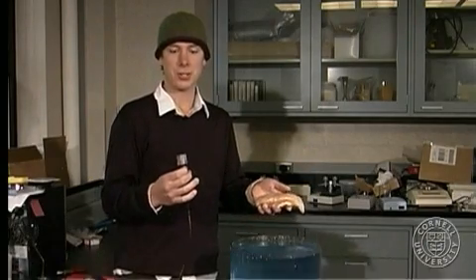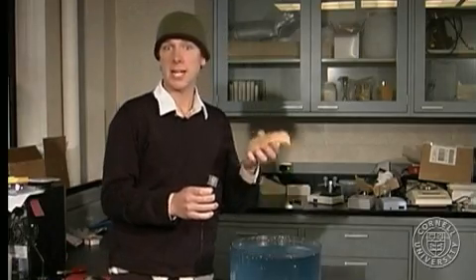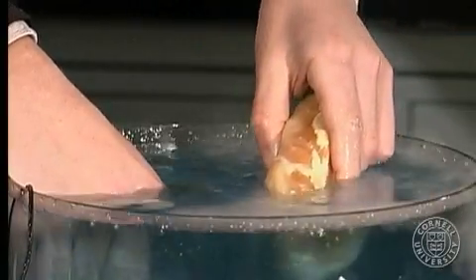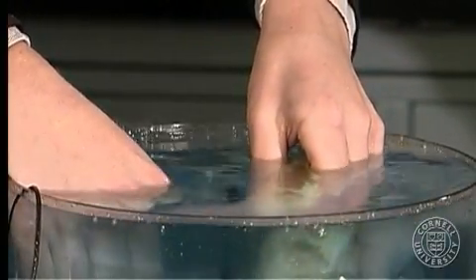Here we have fresh tissue and our ultrasound transducer. We're going to use ultrasound power or energy to burn this tissue that might be in the human body and potentially could be a cancerous tumor. Ultrasound energy is on. We're coupling it through just a plain water bath.